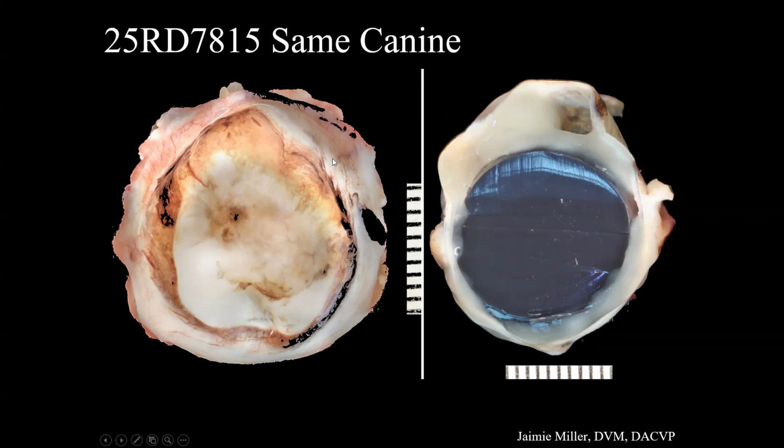All right, so we have the front view of the globe. Believe it or not, this is cornea, and you should be able to see through your cornea. It should be clear. You should be able to see inside, but in this case, it is very opaque. We've got a little bit of pigment on the periphery here, and it's pretty solid. And this limbal sclera is a little bit irregular. It's a little bit bulgy, kind of where they were noting their findings clinically.